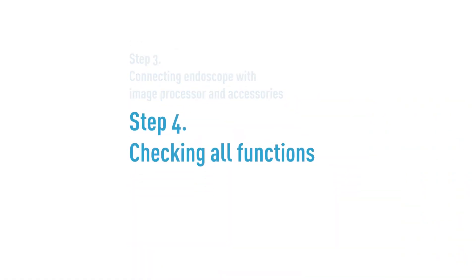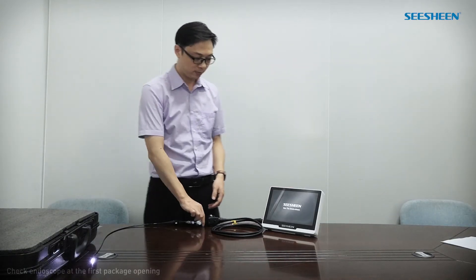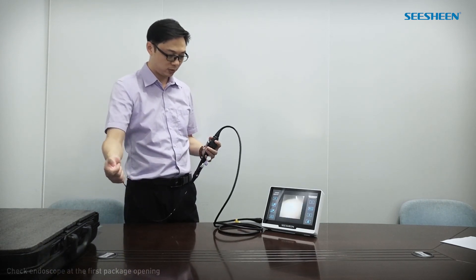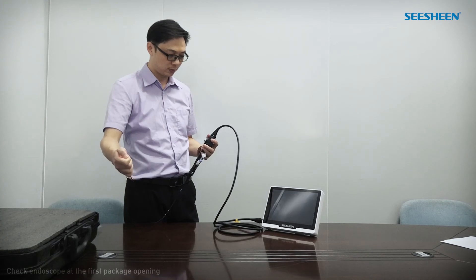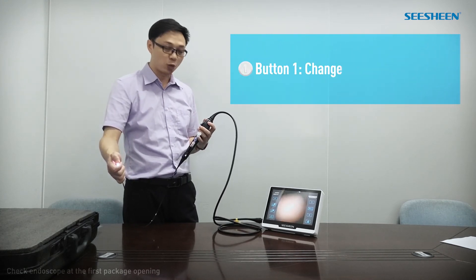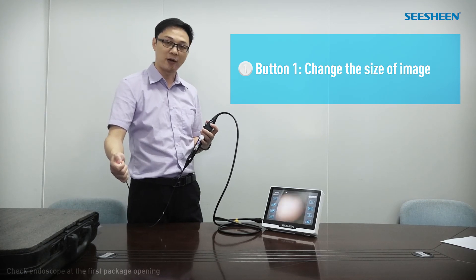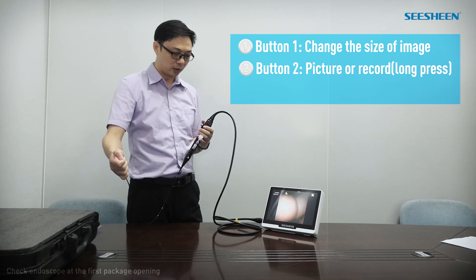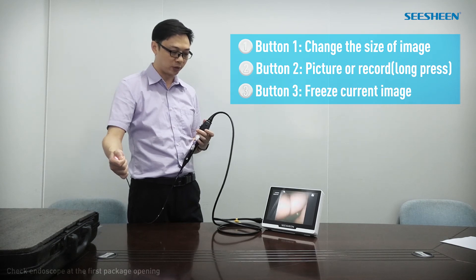Step 4: Checking all functions. Power on the system. Test the buttons on the endoscope. Button 1 is to change the size of the image. Button 2 is to take a picture, and a long press is for recording.